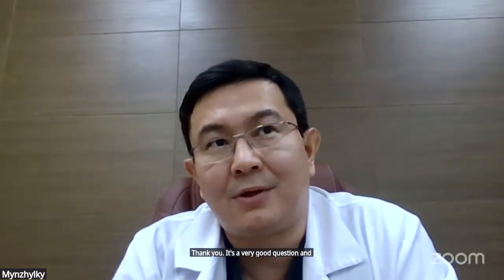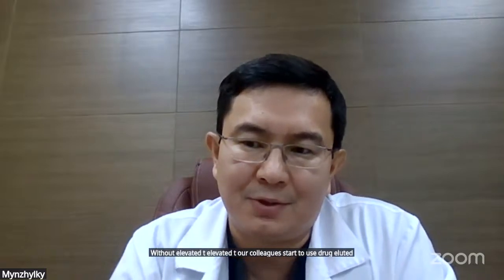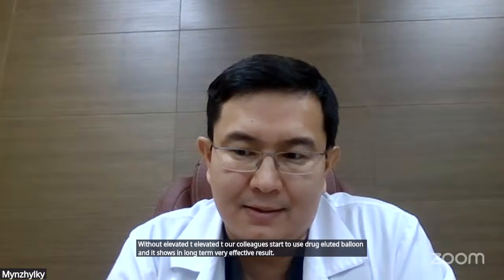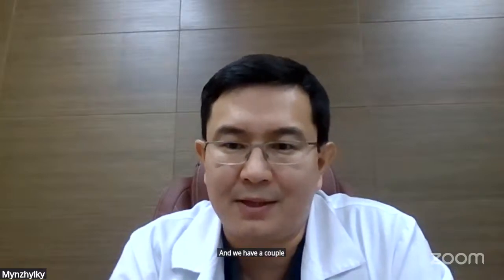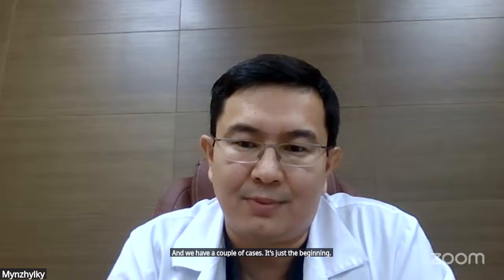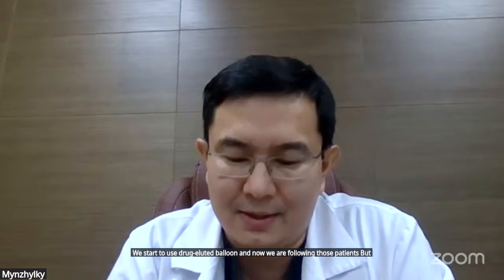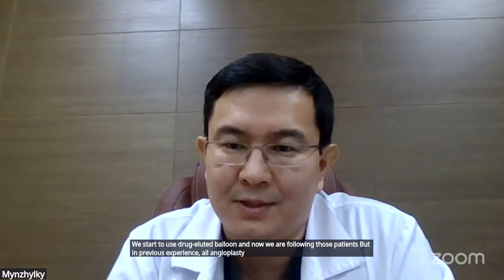Thank you. It's a very good question. And nowadays in coronary practice, it's also changing. And there is experience in non-STEMI patients without myocardial infarctions, without elevated troponin. Our colleagues start to use drug-eluting balloon, and it shows in long-term very effective result. And we have a couple of cases. It's just the beginning. We start to use drug-eluting balloon, and now we are following those patients. But in previous experience, all angioplasty was followed with the stenting.